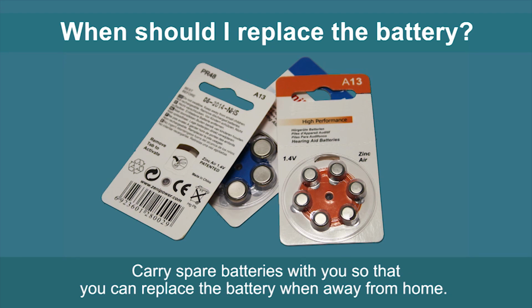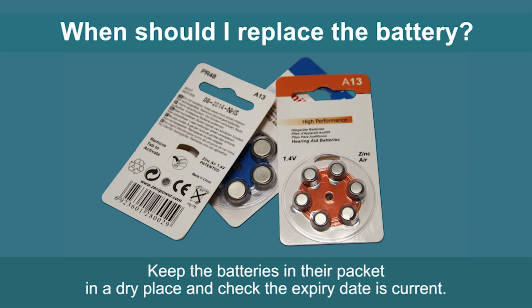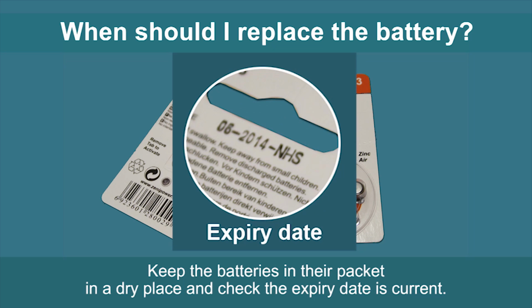Carry spare batteries with you so that you can replace the battery when away from home. Keep the batteries in their packet in a dry place and check the expiry date is current.